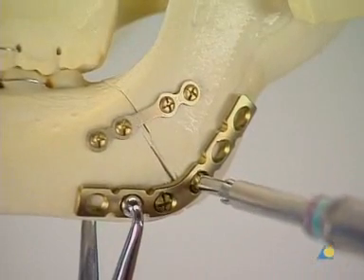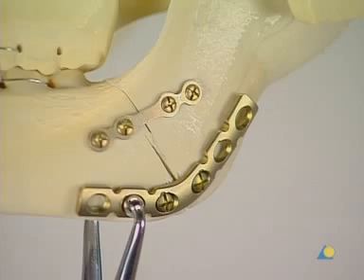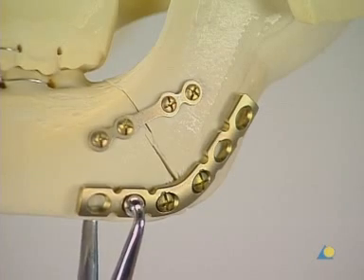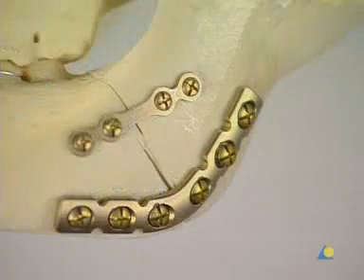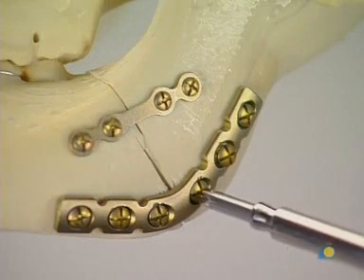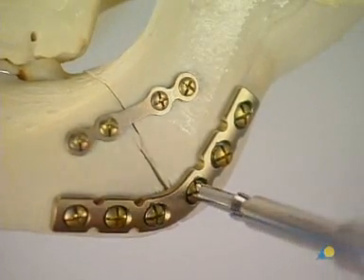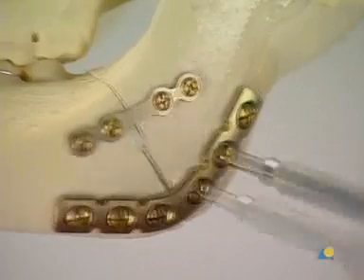If the plate-holding forceps was used, it should now be removed. Neutral screws are inserted into the remaining plate holes and all the screws are tightened.